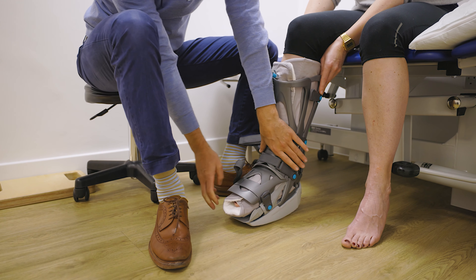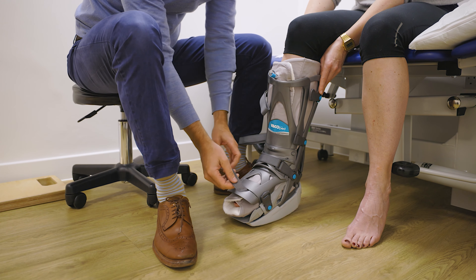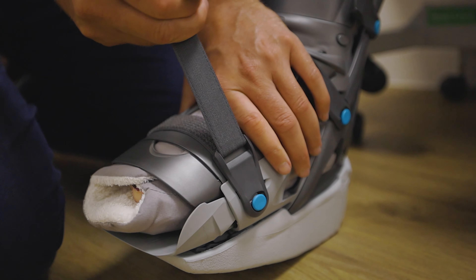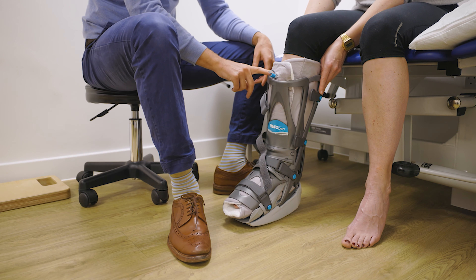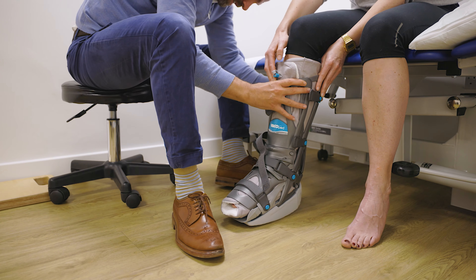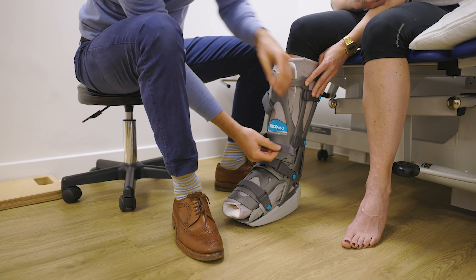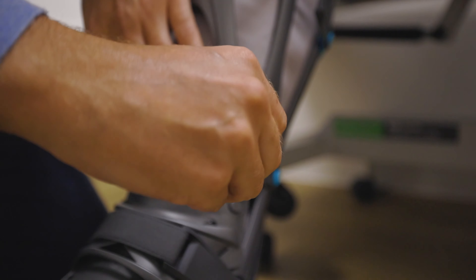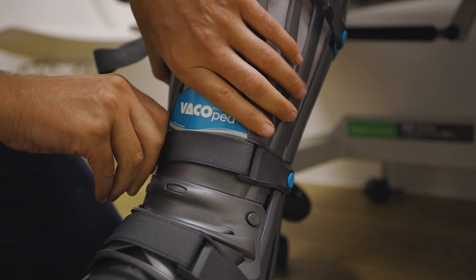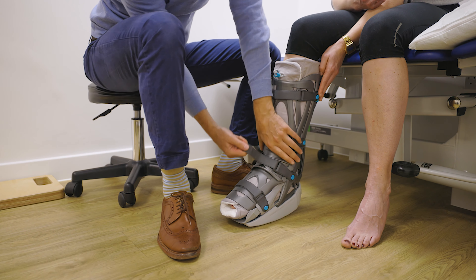You don't want to stop blood supply to their toes, but it does need to be quite firm because it gives you the structure to make sure you don't go out of the position that you want. Pull that strap. At the top, the skeleton actually goes over the top — so it overlaps. Make sure they're nice and even. Remember: at the bottom it goes on the inside, and at the top it goes over the top. Put these straps on — you can start off with them a little bit looser so you don't shock your patient too much, then go around and tighten up. Do make sure the valve is free and not overlapped by the straps.